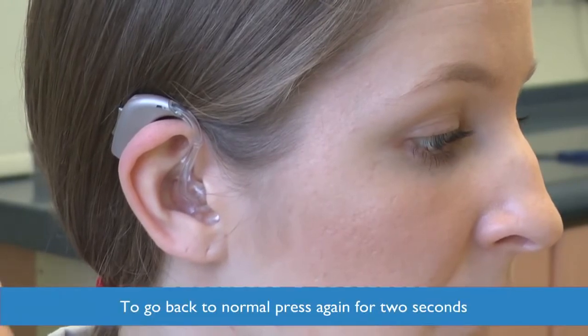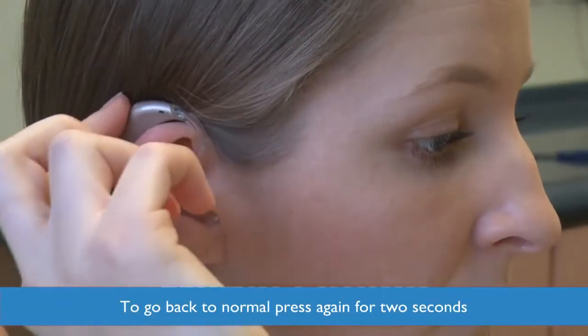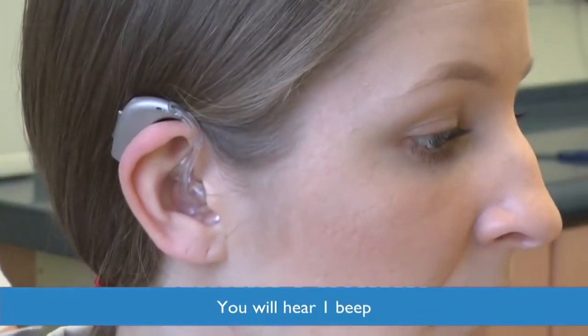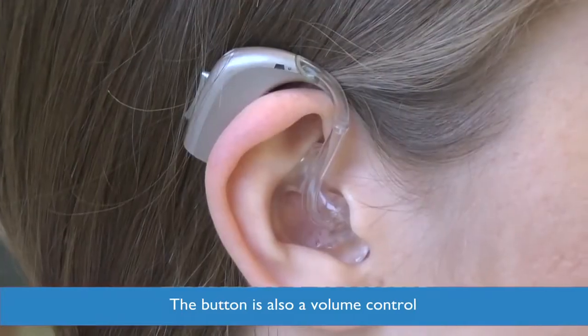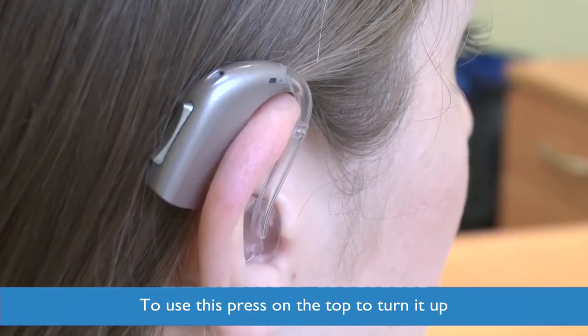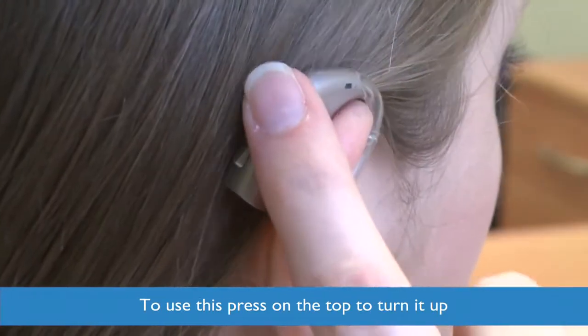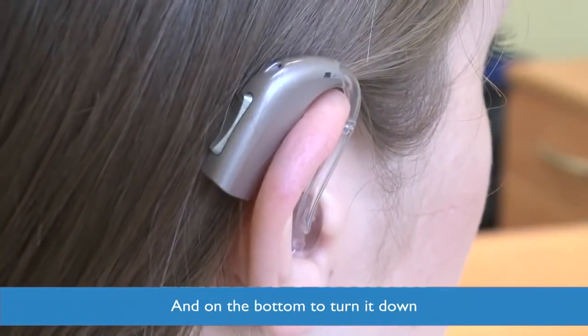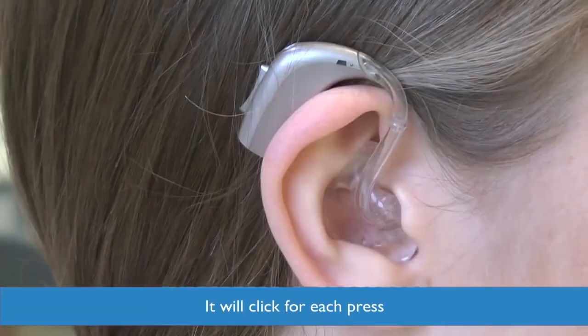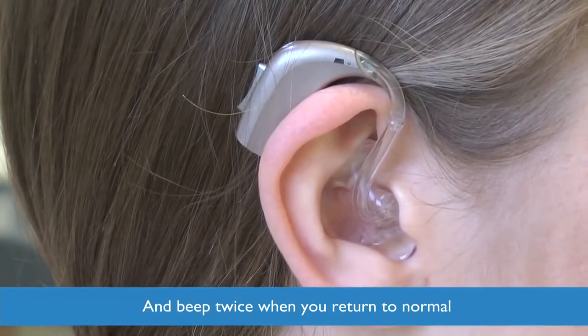To go back to normal, just press the button again for 2 seconds. 1, 2. And you will hear 1 beep. Another option for the button is a volume control. To use this, press on the top to turn it up and on the bottom to turn it down. It will click for each press and beep twice when you return to normal.